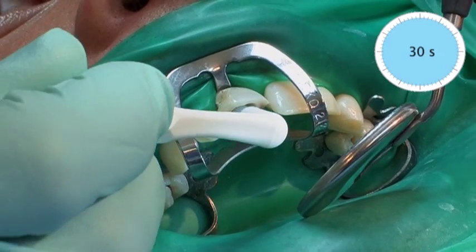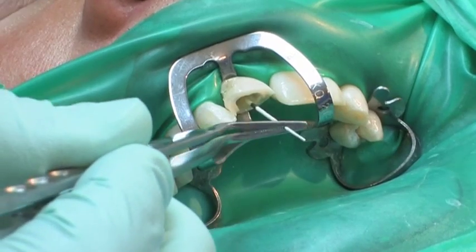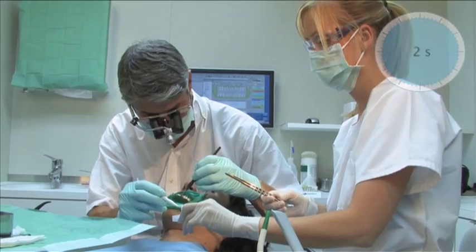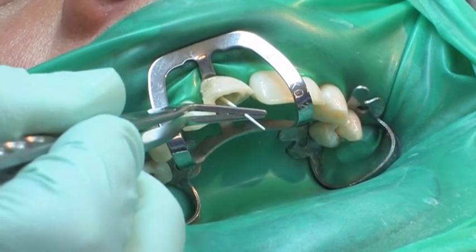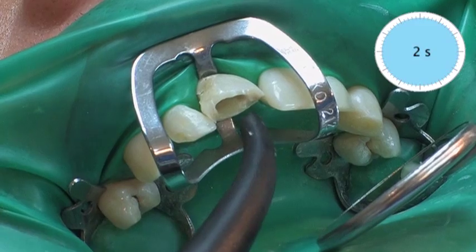Parabond non-rinse conditioner is massaged into the root canal and onto the tooth surface. Excess conditioner is removed using a paper point and dried afterwards using a gentle stream of air. The mixed Parabond adhesive is applied directly into the root canal and onto the tooth structure. Excess adhesive is removed using a paper point and carefully dried afterwards using a gentle stream of air.